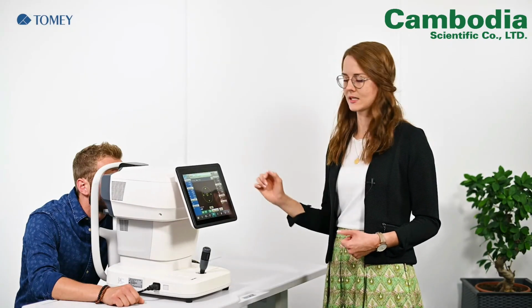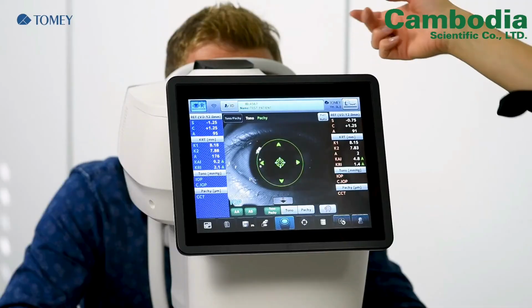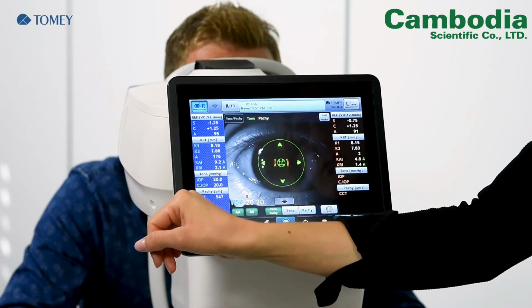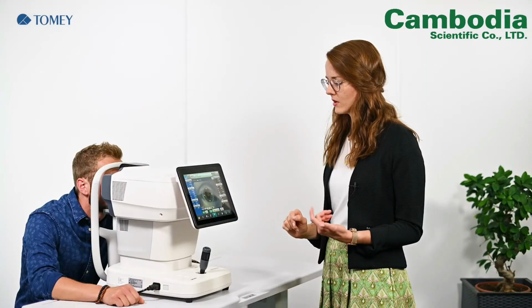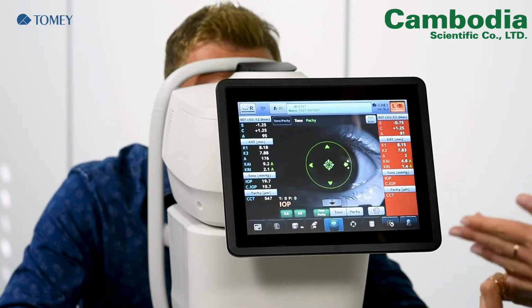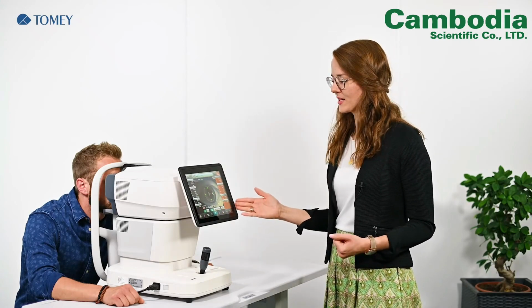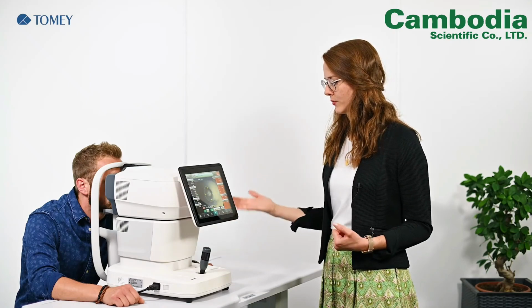Tono and Pachy is another cone. So the cone in front of the device is rotating, and you see in the first step the Pachymetry is measured, and afterwards we have the Tonometry. And for the Tonometry it is possible to choose between a single air puff or 3 air puffs. Okay, so now we have all 5 measurements done. These are the basic measurements which we wanted to perform today.